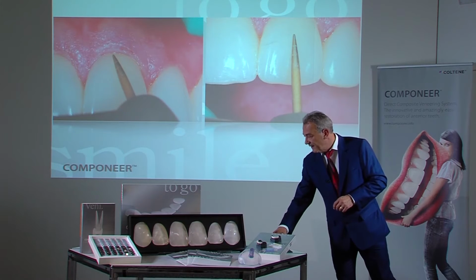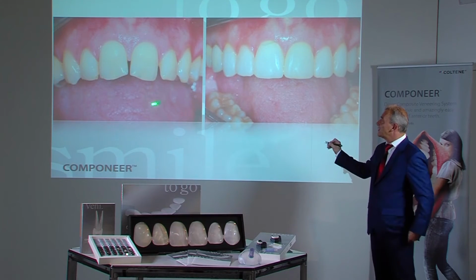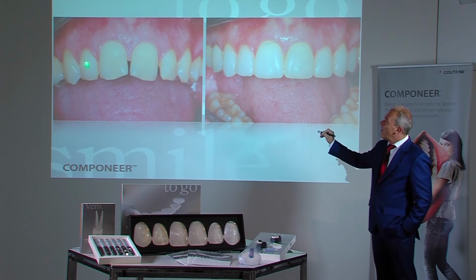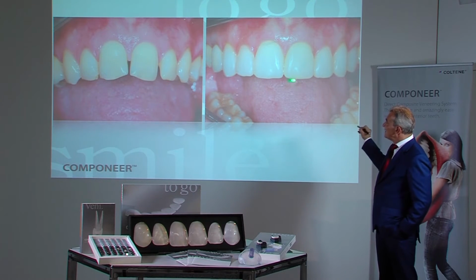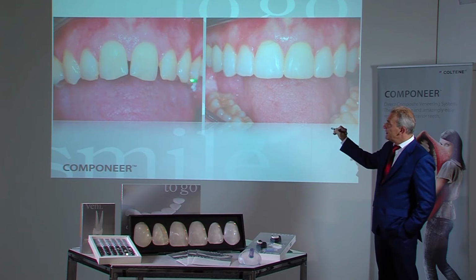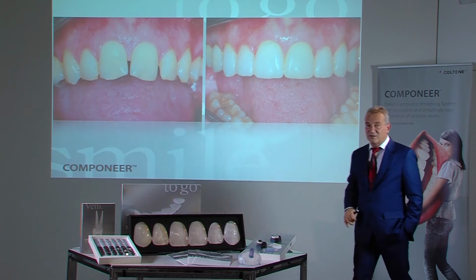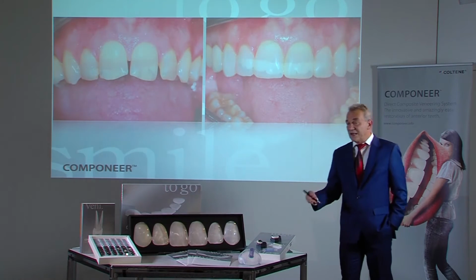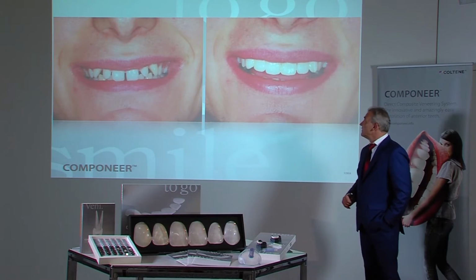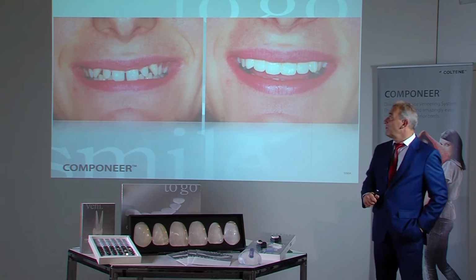At the end, the margins are finished, and the surface contours made a bit more vibrant. Here we can see the surface of the tooth. We have introduced a structure. In the final outcome, one can see the corrected inverted line as well as the removed ugly contrast lines and contrast points. So far, we have encountered no problems, but there are situations with several gaps and partly also with malposition of teeth.